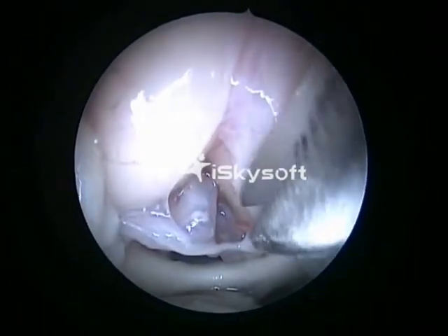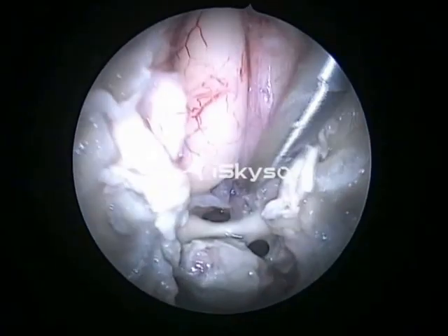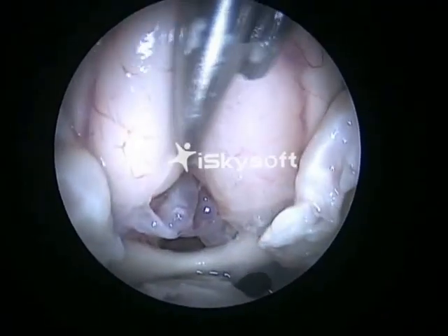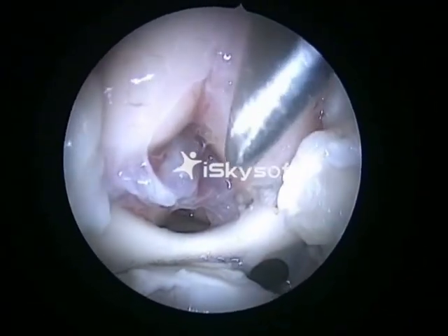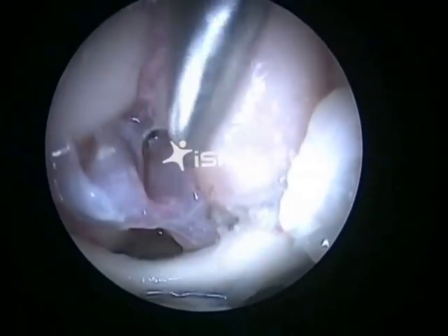That's a clear view of the anterior cerebral artery on both sides, the A1, A2 and the ACOM. That's A2, ACOM, A1.